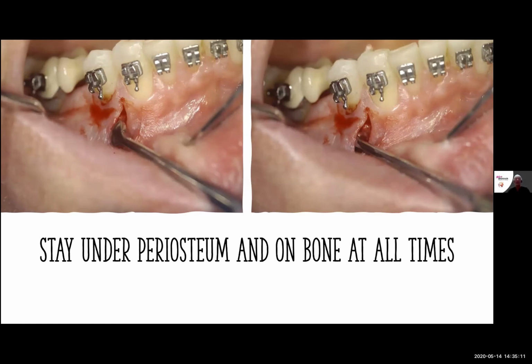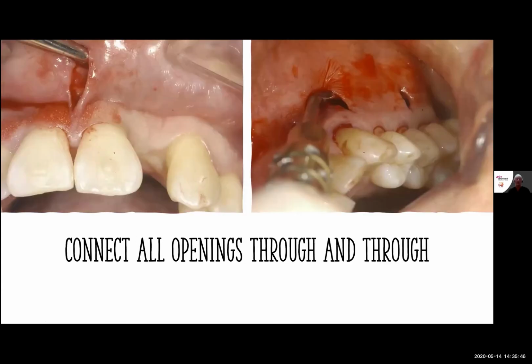And so as we begin the process of opening and creating our tunnel, it's a gentle step that we're doing. Once we get underneath that, this step starts to go faster. But the initial entry point right here is where we have to be a little bit careful. We have to make sure that we're not going to create a split thickness graft or flap, excuse me, but that we are going to be able to move our periosteum and move that up with the mobile tissue itself. And so being able to recognize the periosteum and know where that is and what that is so that we're getting underneath that is also a key.